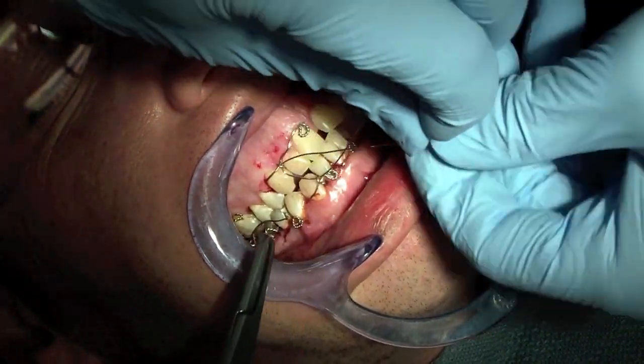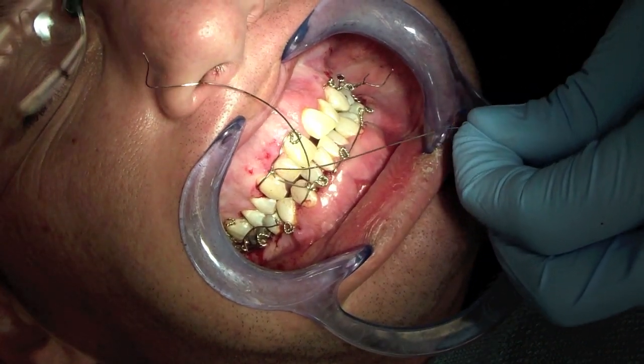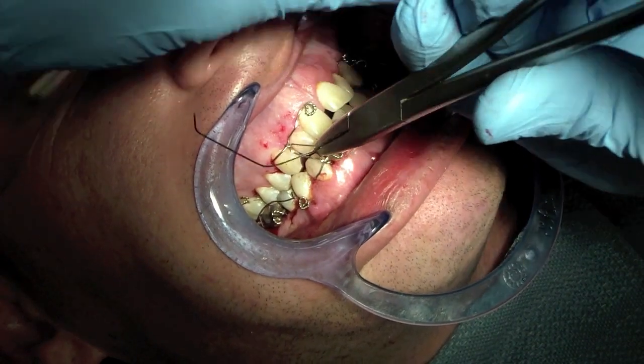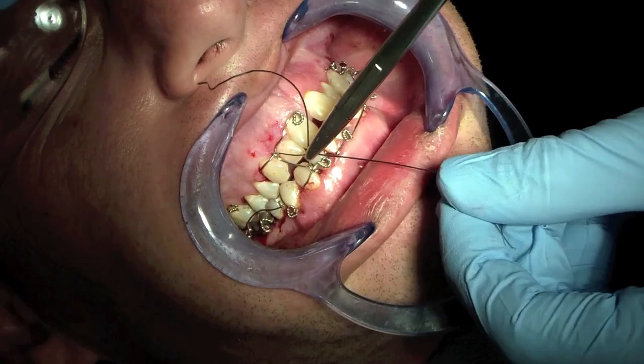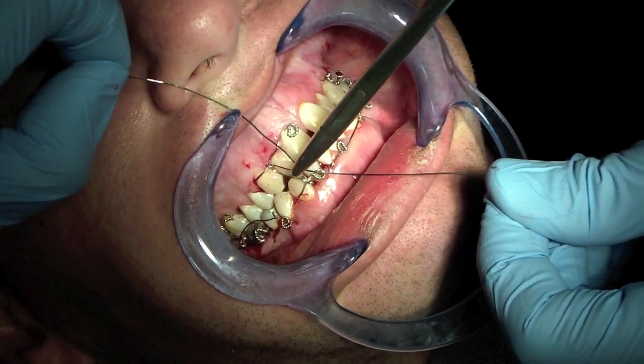So I grasped it way too close to the teeth. I should have been a little bit further back, and what happens is I'm trying to pull and now the wire is starting to twist down on itself and then it breaks.